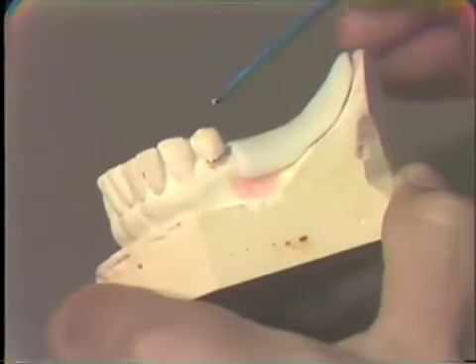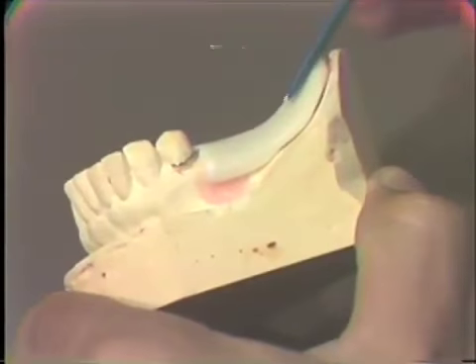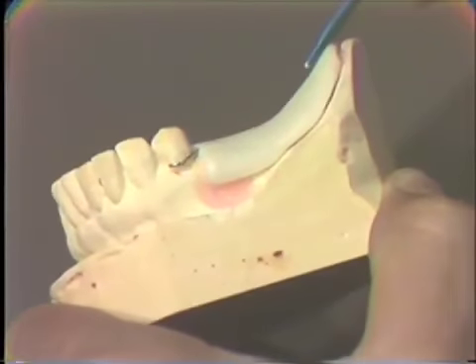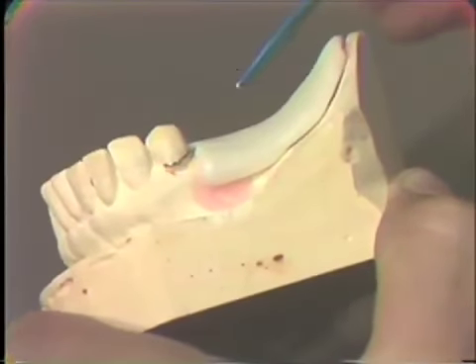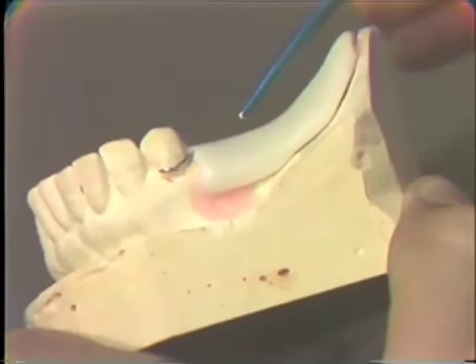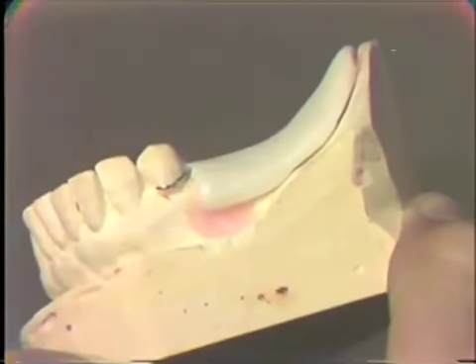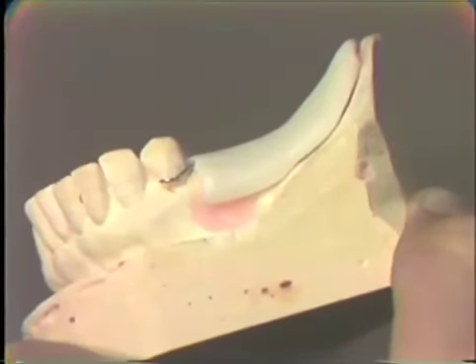Now, it is not necessary in the fabrication of that to put the wax rim along the whole surface, but it should be done at the time of the delivery to the patient so we can see what the opposing occlusion is and how far down the opposing occlusion will come.